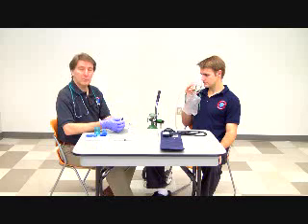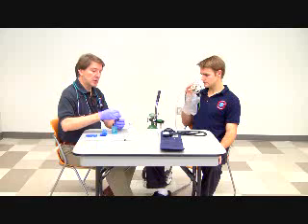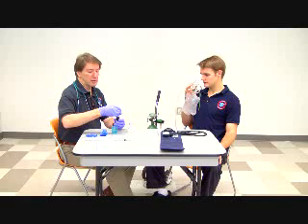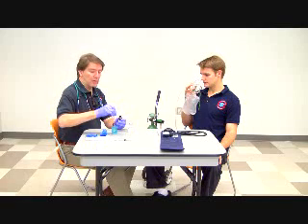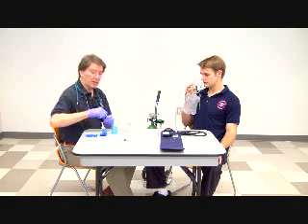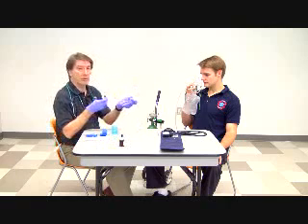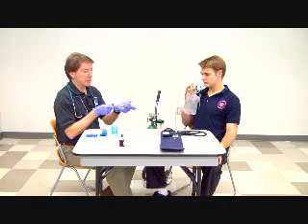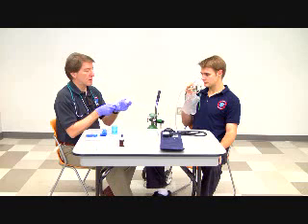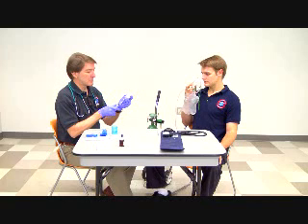If, on the other hand, you're administering albuterol in a concentrated dose, you have to then dilute it. So you would simply take your medication, drop the amount that the physician has ordered into the nebulizer bowl, and you next have to pre-dilute the medication with saline. Now, I've already pre-prepped this vial, and I'm going to draw off 3 cc's of saline, which I will use to dilute the medication.